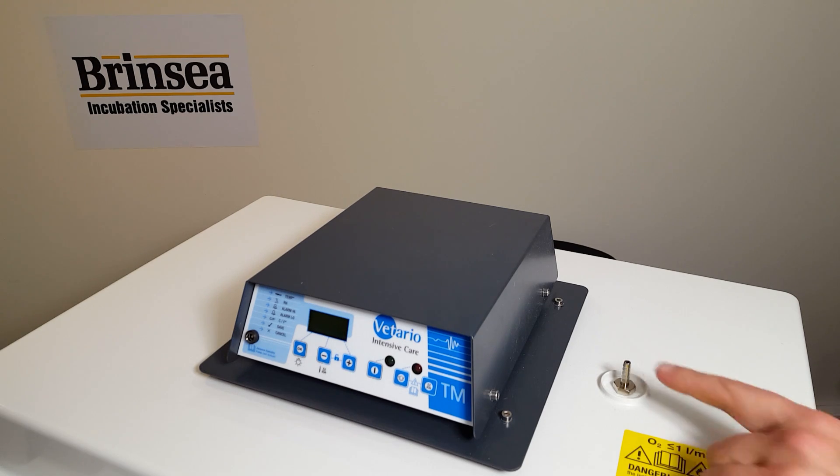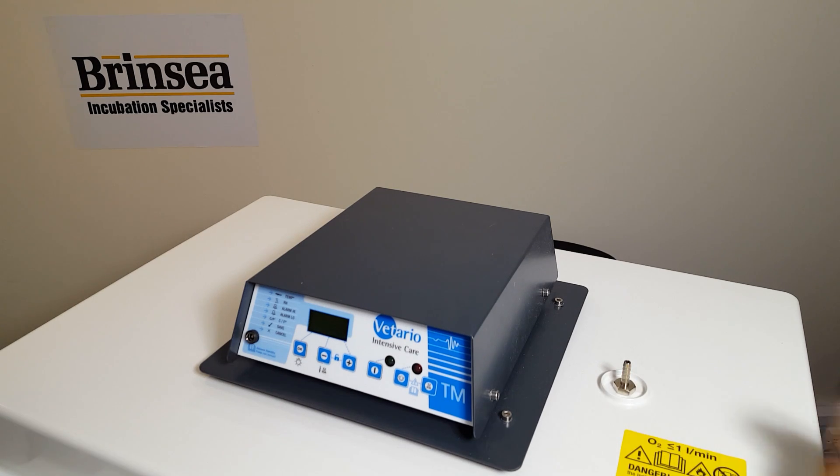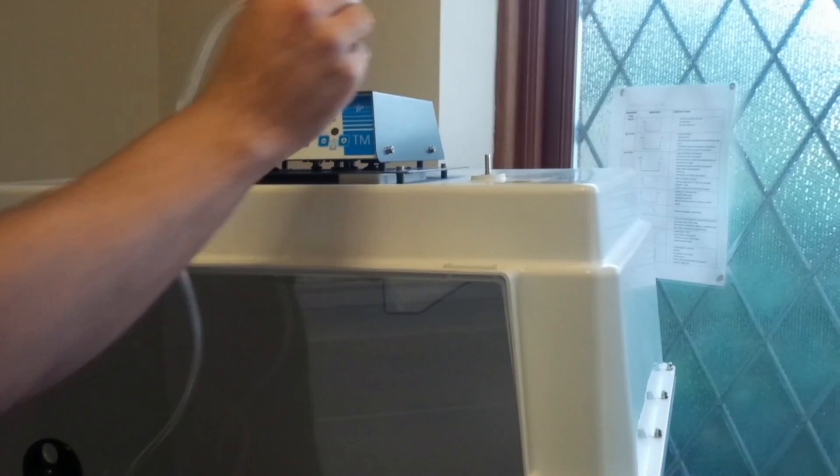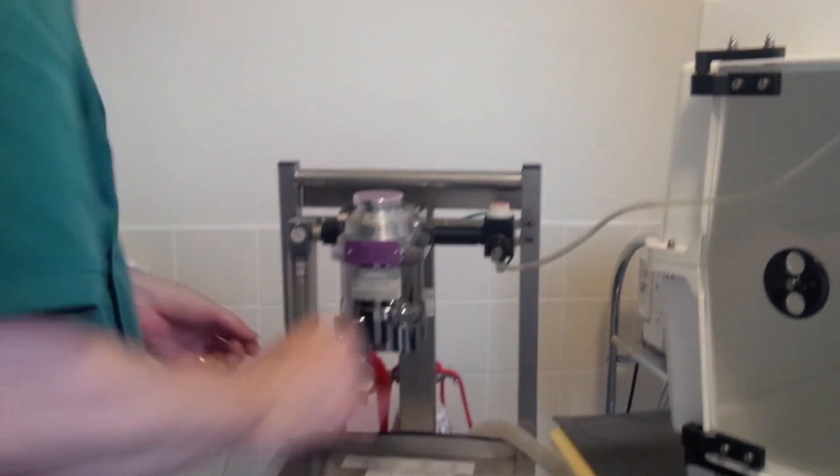The units are fitted with an oxygen connector and veterinary surgeries will have their own oxygen systems for connection to this unit. One of our veterinary customers is demonstrating here how the connector is used to connect to his mobile oxygen system.